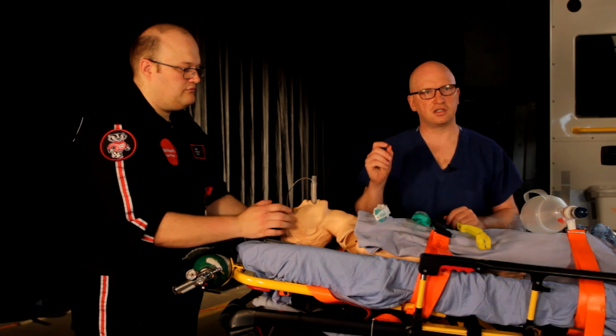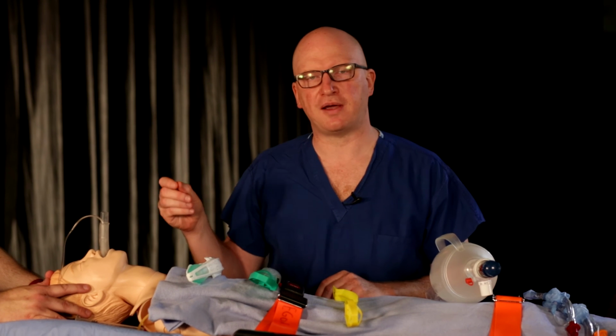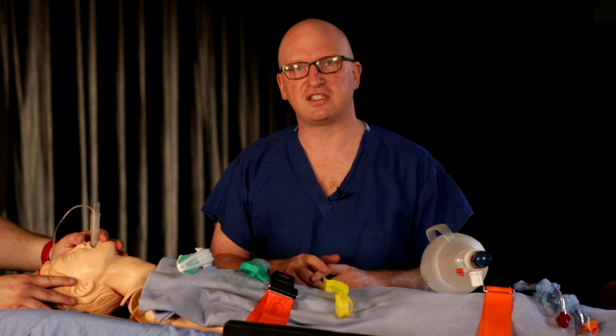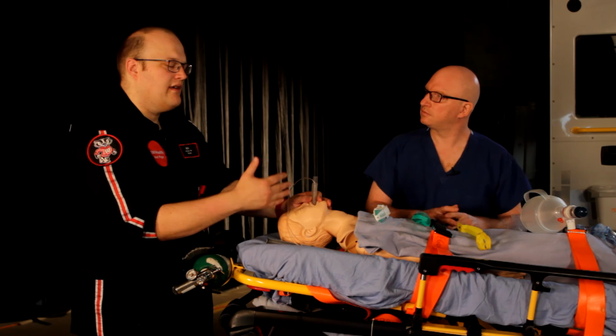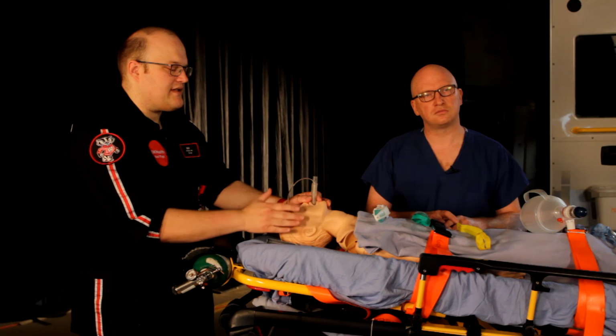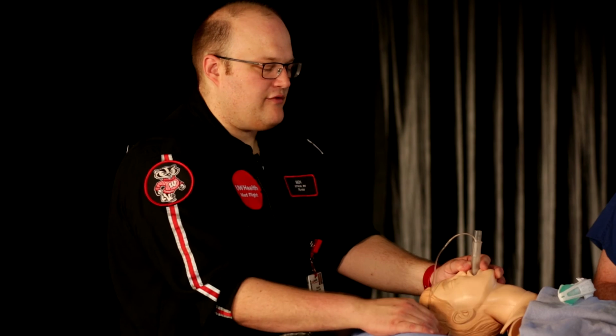Once you get that tape on there, even then you've got to remember that you've got to always keep a hand on the tube anytime that patient moves, anytime you are thinking you're going to do anything that could potentially dislodge the airway. You need a hand right on the tube, even if there's tape or a securement device in place. Once we place this device, this is my only job. So I will be at the head no matter what. I have no other skill set right now except to make sure this patient's airway stays in and the child stays alive.